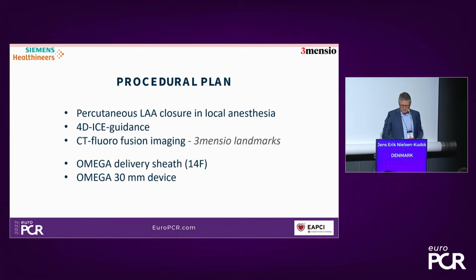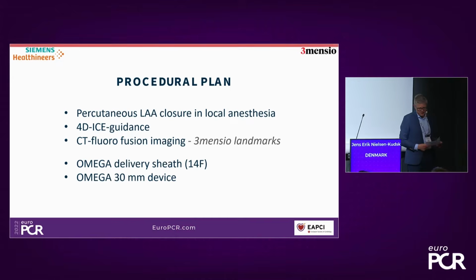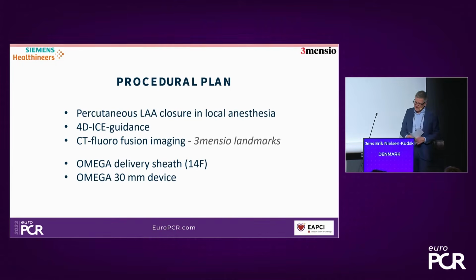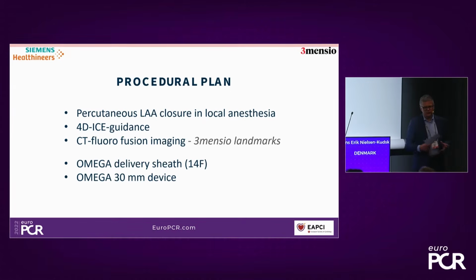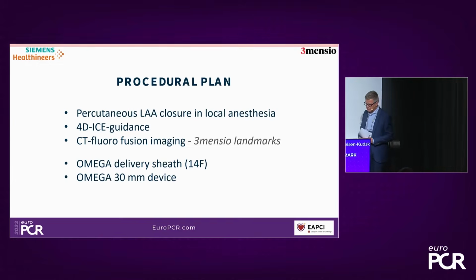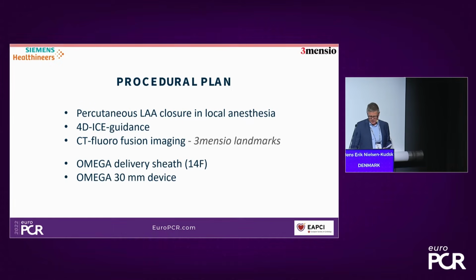So here in Copenhagen, based on those pre-procedural images, they actually planned to do this procedure in local anesthesia guided by intracardiac echo. And this is with an advanced 4-dimensional ICE probe. And what is also nice from cardiac CT is that you can use fusion between CT and your angio projections, as we will see later on in the case.